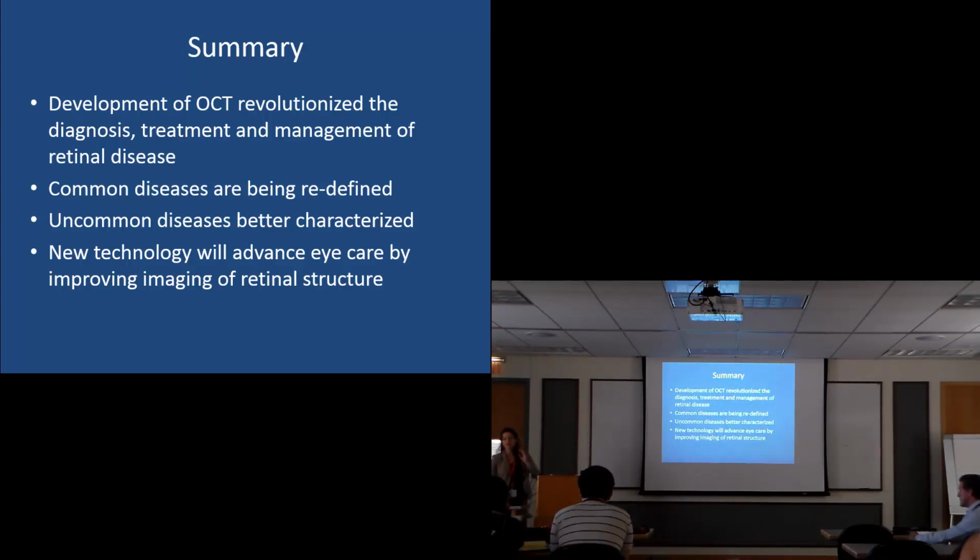Well, there's lots of optical devices that we use to image the different parts of the eye. The wavefront technology that has been used with adaptive optics is also used with corneal topography to try to get an exact image of where everybody has different bends or defects in their cornea. So there are different ways of doing it. Optical coherence tomography is one. Then we have confocal imaging. The autofluorescence really comes down to a pinhole technology to filter out the wavelengths, and based on the wavelengths we can tell depth with a confocal. Most of them are being combined into one device now.